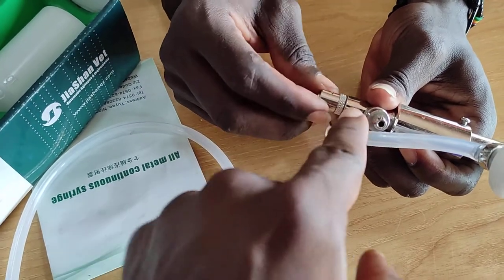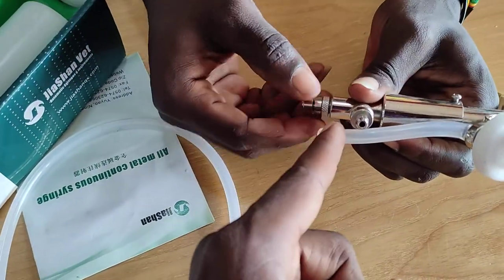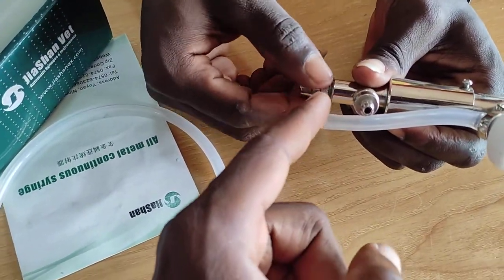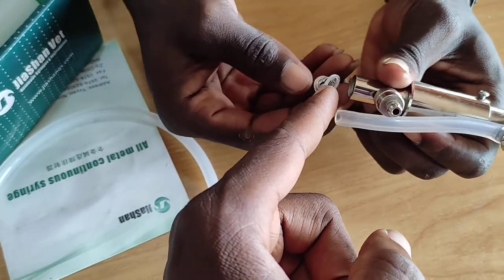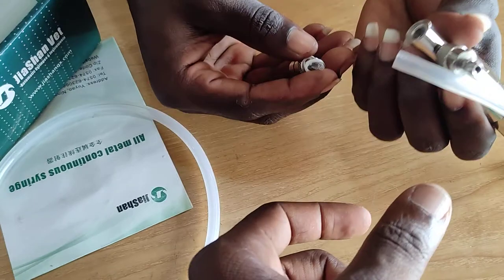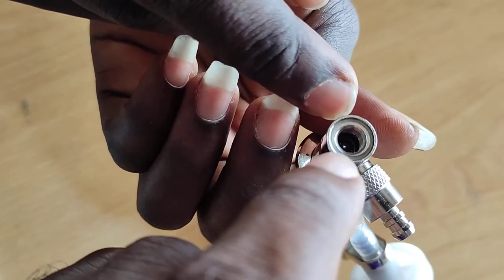But if you mistakenly open the whole thing — open here too — it's going to come out like this. And then you see the spring, the seal, and also a ball. There's supposed to be a ball in this.